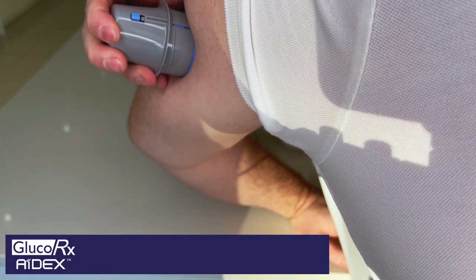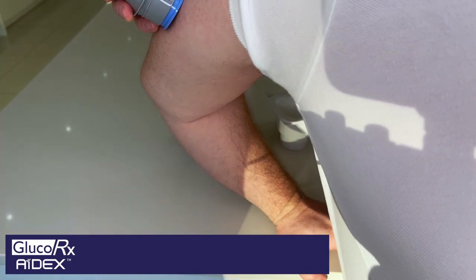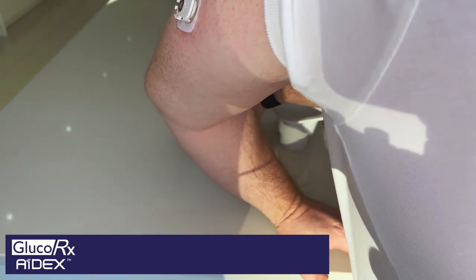That then raises this blue button here — as you can see, there's a blue button there. And then once that is depressed firmly into the surface, you push the blue button like that. That has then put the sensor in.